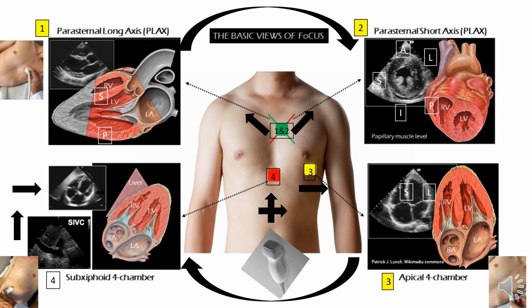Then moving towards the apex, the apical four-chamber view. If the aorta is closed, it is the posterior septum supplied by the PDA branch of RCA. Tilting slightly anteriorly and getting the aorta open at the apical five-chamber view, we'll get the anterior septum supplied by LAD and the apex supplied by LAD also. Lateral wall supplied by the circumflex.